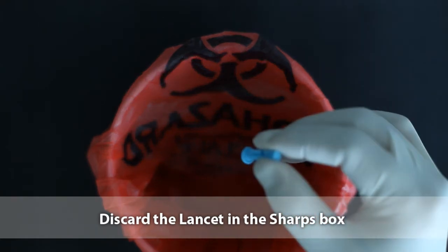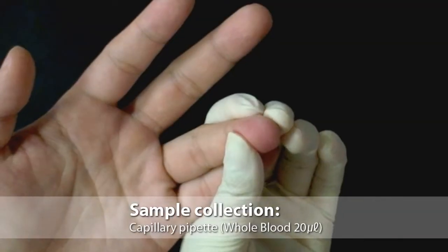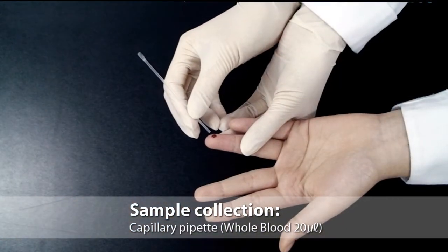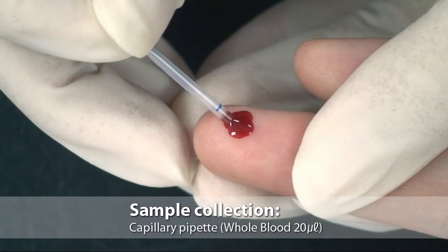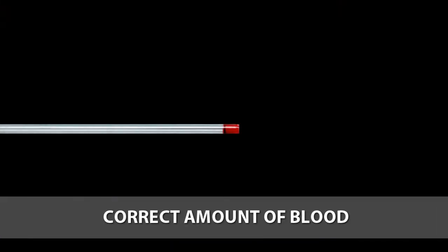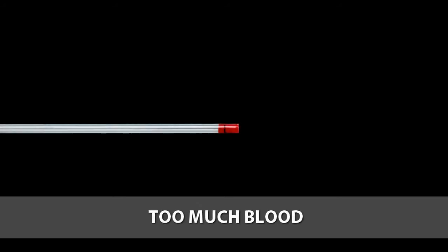Discard the lancet immediately after pricking the finger. As the blood bubbles up, take a disposable capillary pipette and draw the blood into the capillary pipette to the black line. The amount of blood collection is critical. This is the correct amount of blood. It is too little. It is too much.